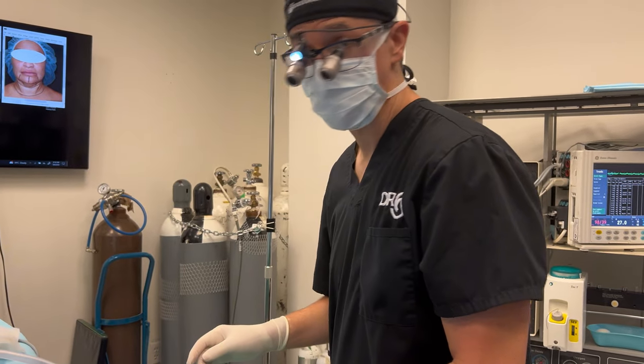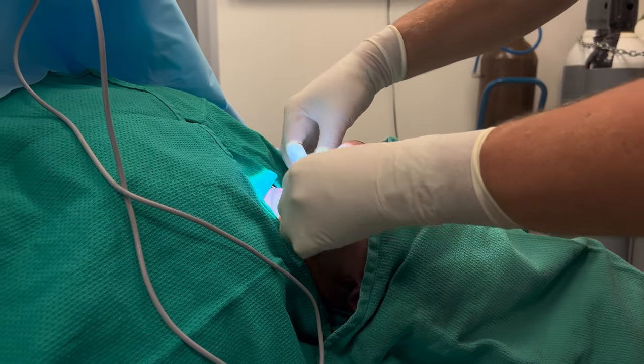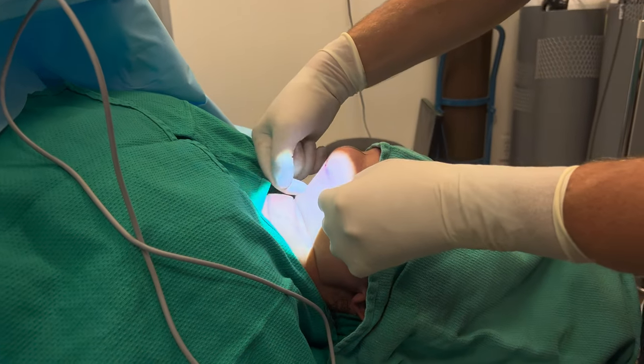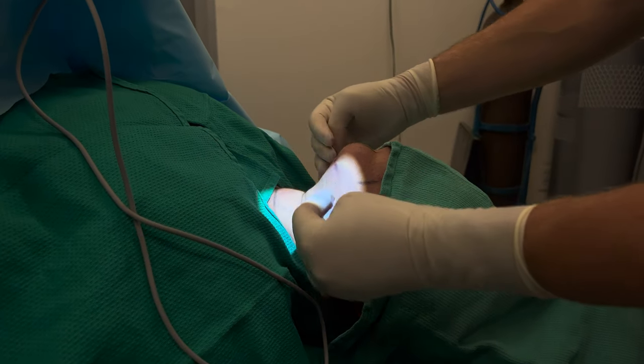Liposuction is done. We got about 150 cc of fat out of this neck, which is sizable. I made her nice and thin — not paper thin, we want to leave some fat underneath the skin — but it's nice and thin. Now I'm going to make an incision, go deep, and explore the subplatysmal fat and tighten up the neck muscles that create the floor and give her a nice shape.